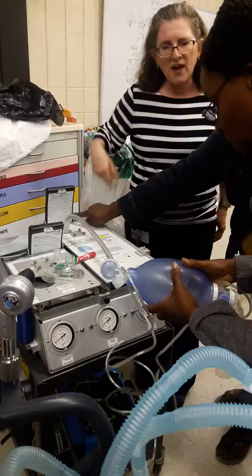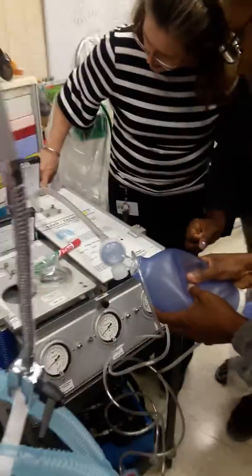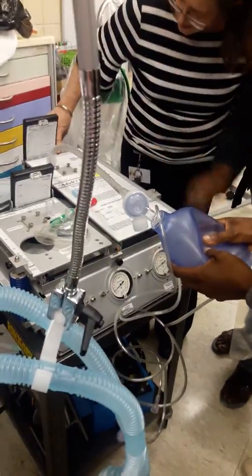Squeeze up to 500 and hold the breath in. Hold it. Up to 0.5 here, right there. Okay. Now look at the pressure.